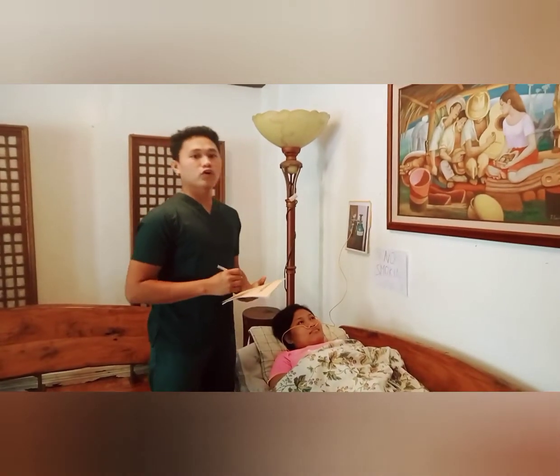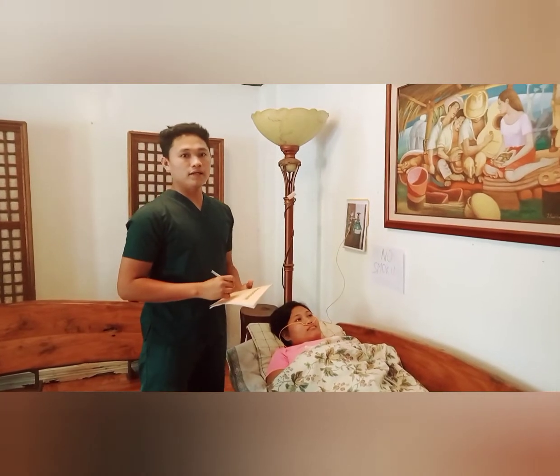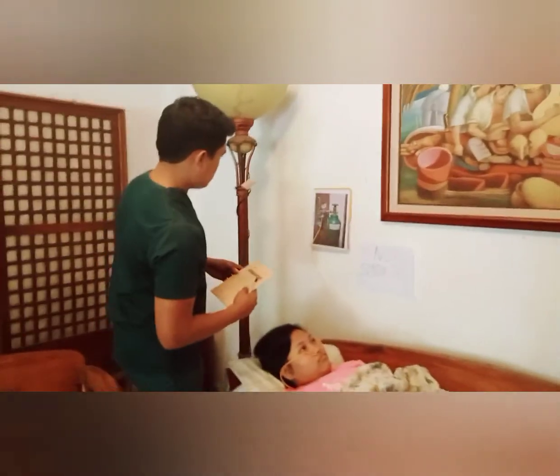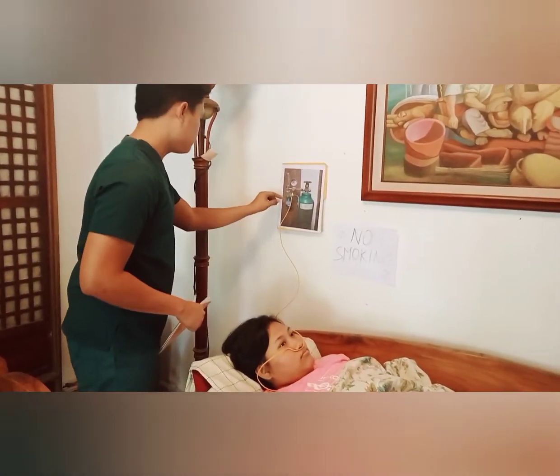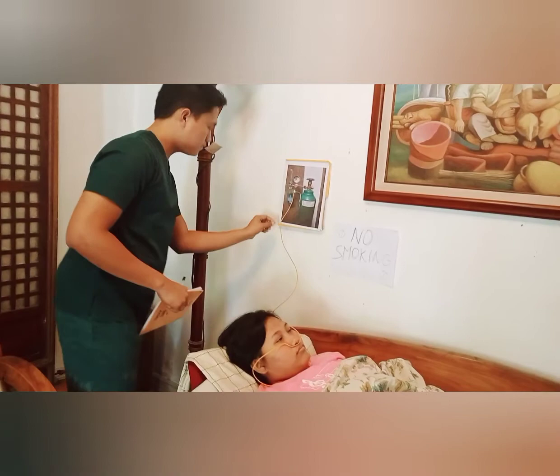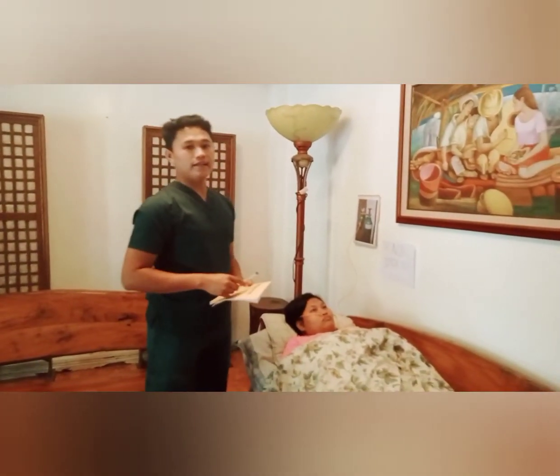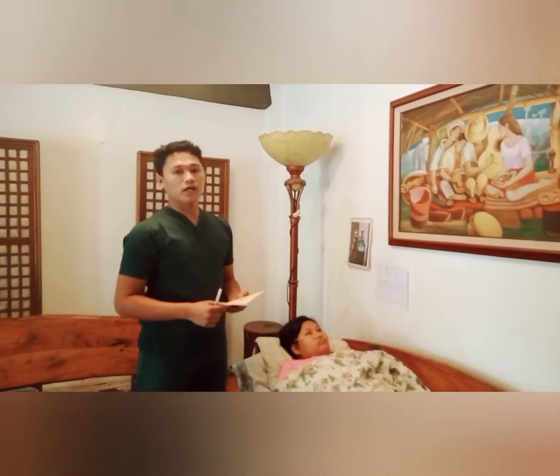So next, we are going to check the oxygen setup, including the water level in the humidifier. So check the oxygen setup. Then check the cannula and assist the client every 8 hours. Sterile water needs to be added when the level falls.